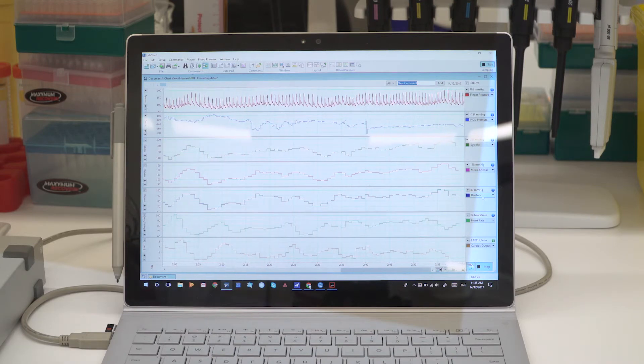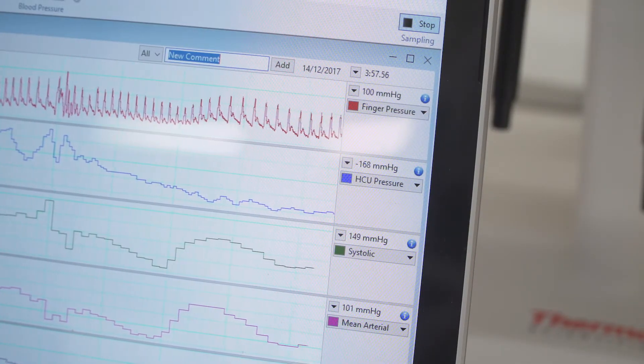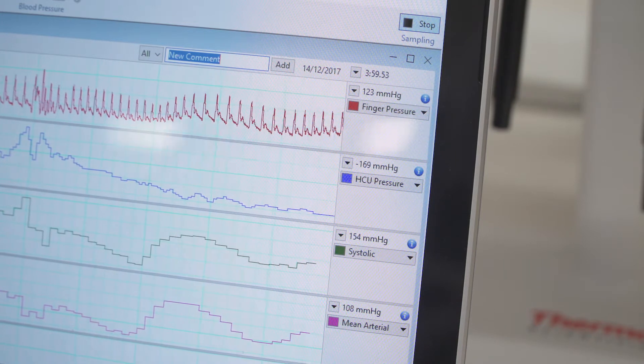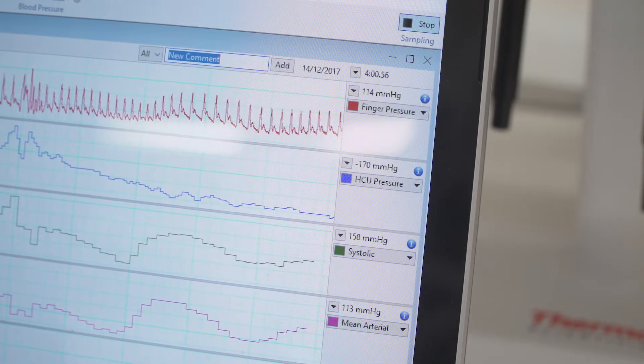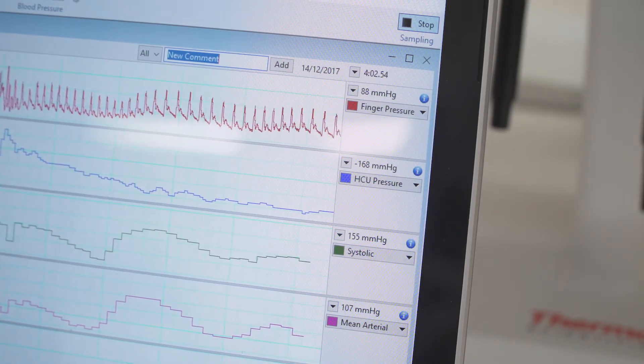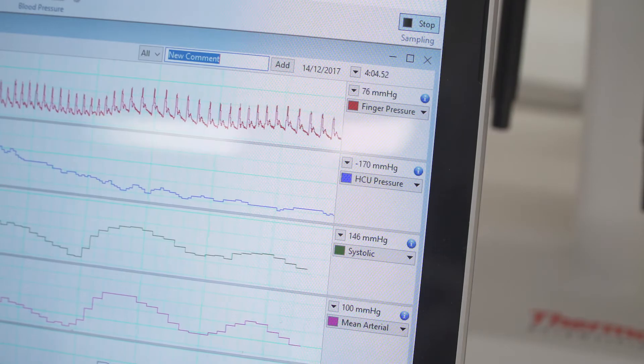What you can see in LabChart here in the first channel is the raw data, and we can see calculated parameters which we had with our existing system, including systolic blood pressure, diastolic blood pressure, and mean arterial pressure.